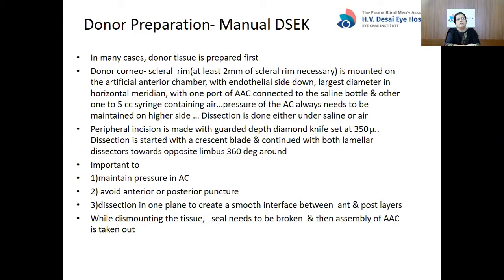The donor is mounted on the artificial anterior chamber with the endothelial side down and the largest diameter in the horizontal meridian, with one port of the chamber connected to a saline bottle and the other to a 5cc syringe containing air. Pressure in the AC always needs to be maintained on the higher side. Dissection is done either under saline or air. A peripheral incision is made with a guarded-depth diamond knife set at 350 microns. Dissection is started with a crescent blade and continued with lamellar dissectors towards the opposite limbus, 360 degrees around. It is important to maintain pressure in the chamber to avoid anterior or posterior puncture.